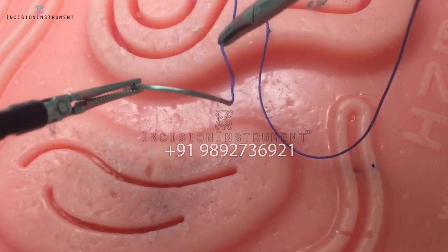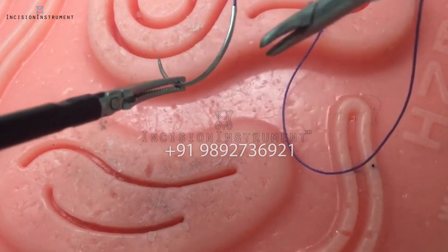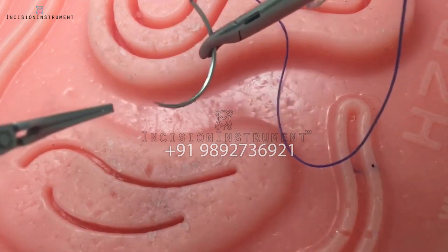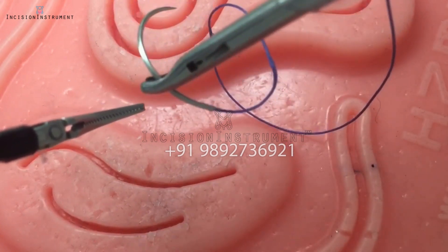Needle loading. Swivel the needle such that the light evenly reflects off point C. Then, using the needle driver, grasp the needle firmly at point C. Release the needle from your left instrument and do a couple of practice throws to ensure the needle was loaded approximately 90 degrees to the driver.